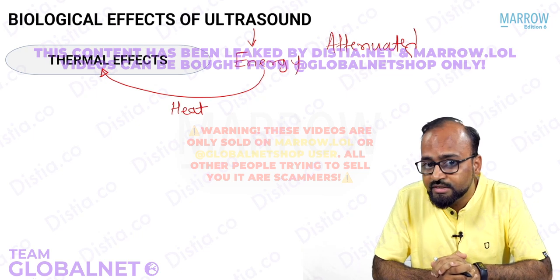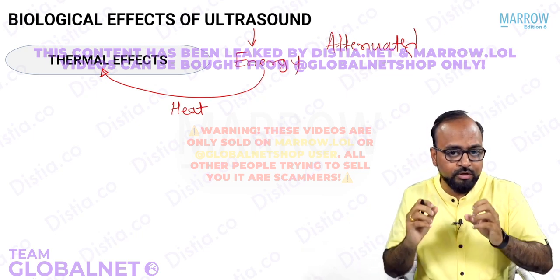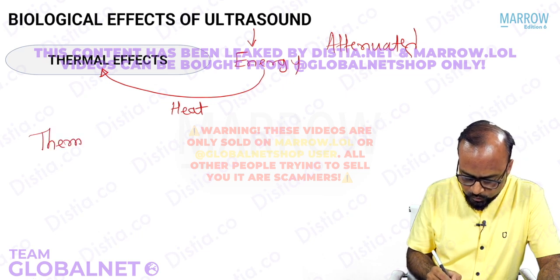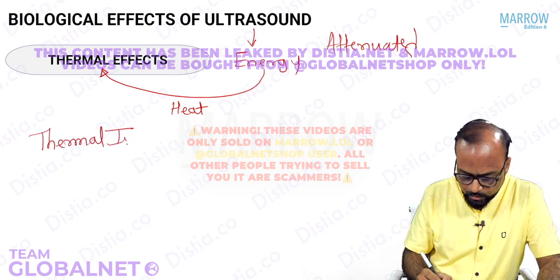So there is an index which is defined. How to measure this particular adverse effect? There is an index which is called the thermal index. What is this thermal index?